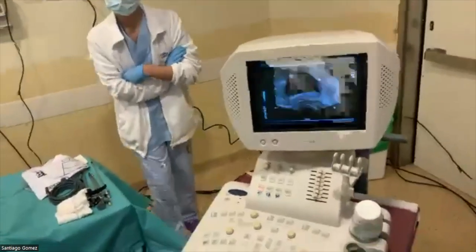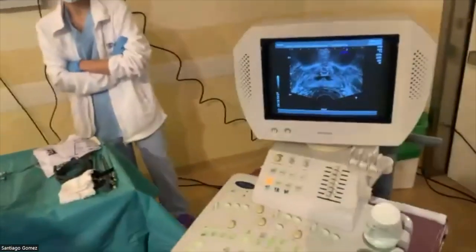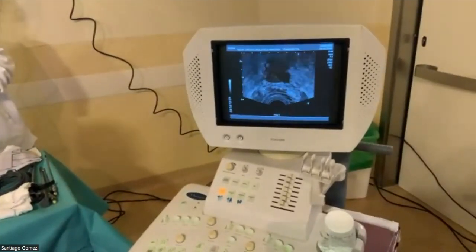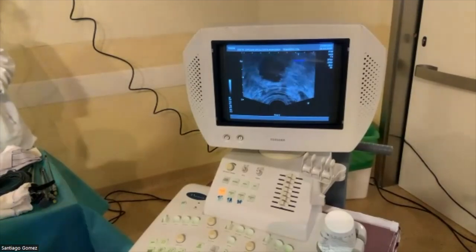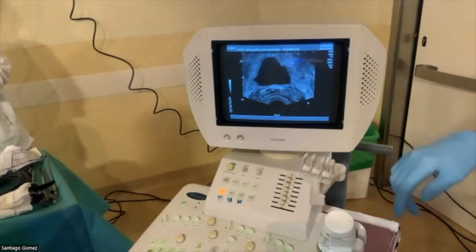Okay. So now you can see. You see, this is the fossa. This is the scope inside the fossa. You can see it's a perfect fossa. There is some water extravasation, you see, below the bladder, because I did a bladder neck perforation, but it doesn't seem too bad.